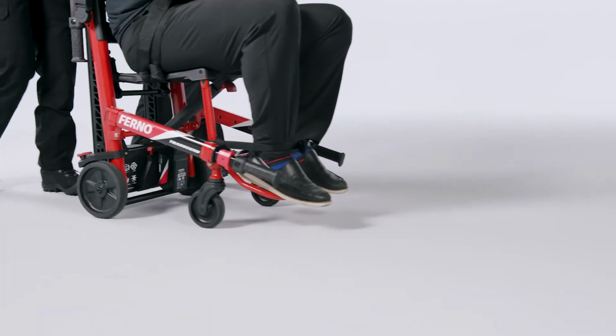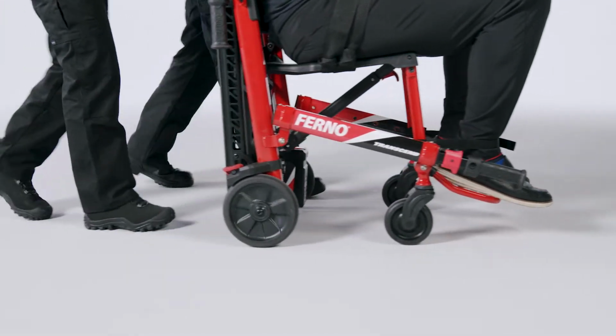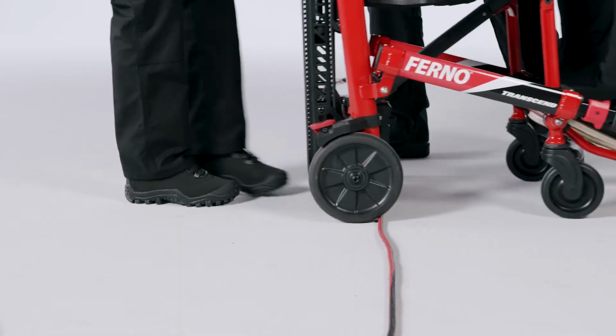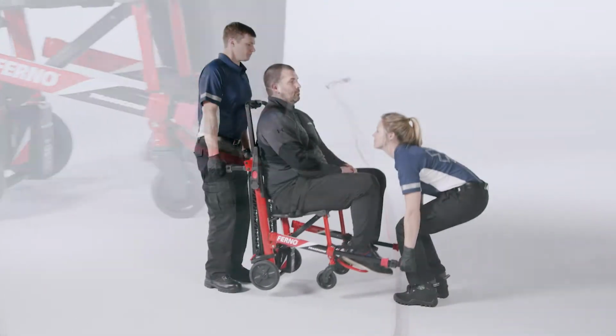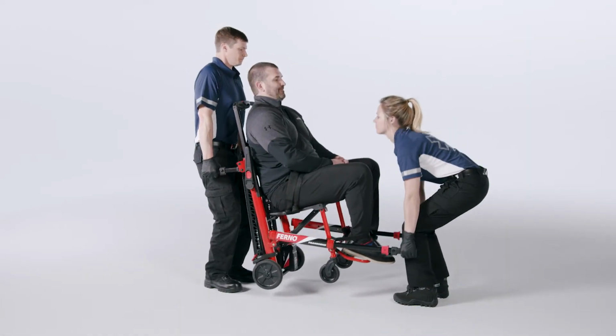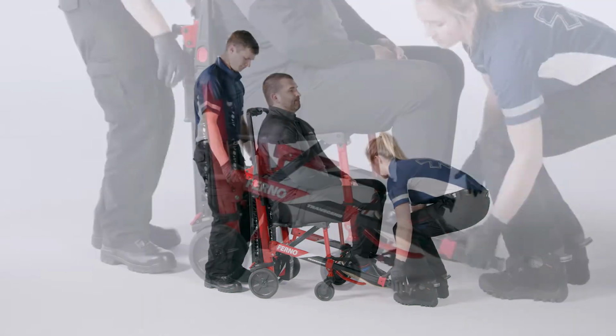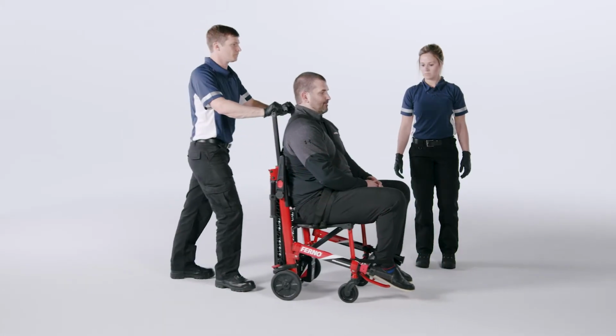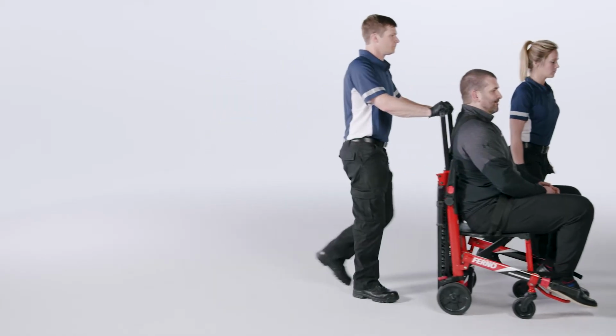Roll the chair on smooth, flat surfaces whenever possible. For patient comfort, pull the chair backwards over low obstacles or lift and carry the chair over high obstacles or rough terrain. To roll the chair, release the wheel locks. Adjust the lift bar to a comfortable height and use it to push and guide the chair.